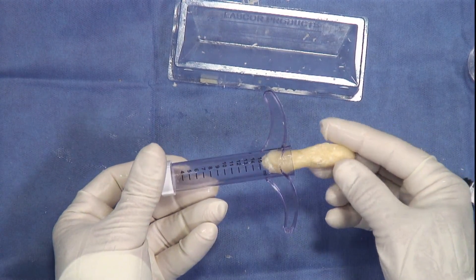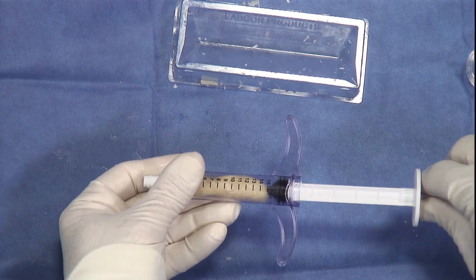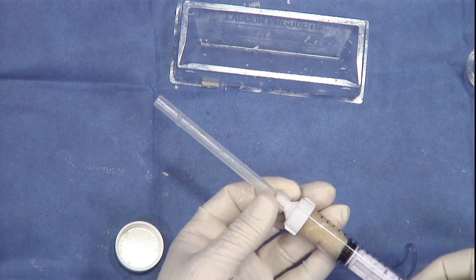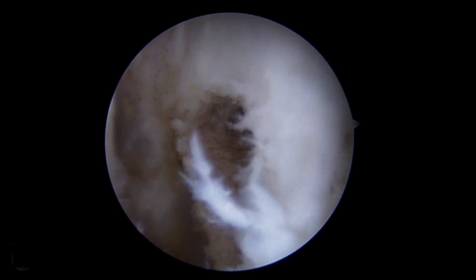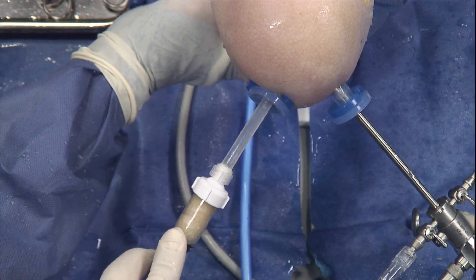Once mixed, it is placed into the osteoprecision graft delivery device. The delivery cannula tip is then tightened onto it. This is our simulated femoral tunnel that we're going to fill with our DBM and cortical fiber mixture.